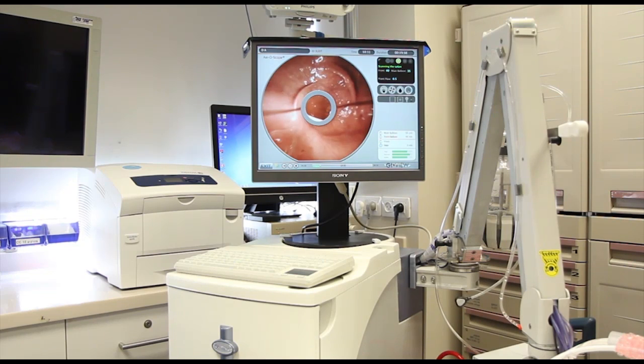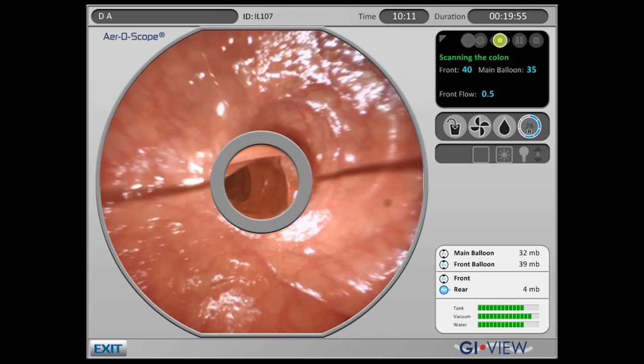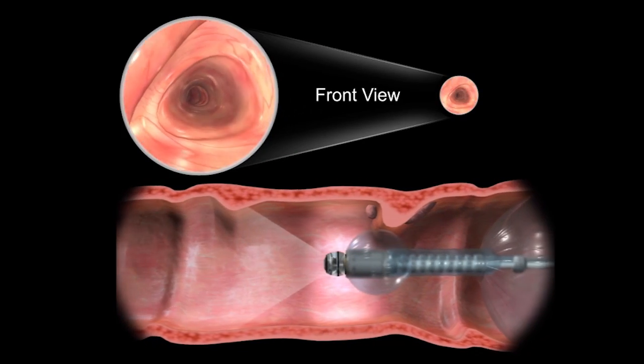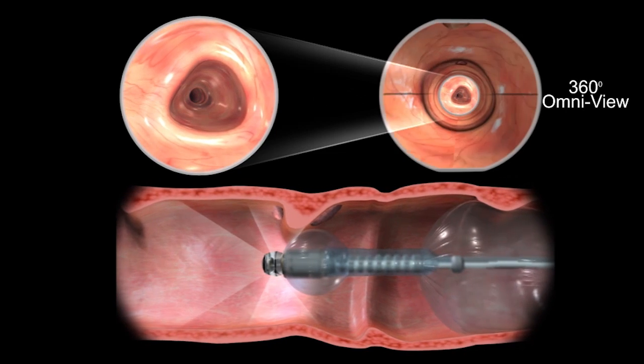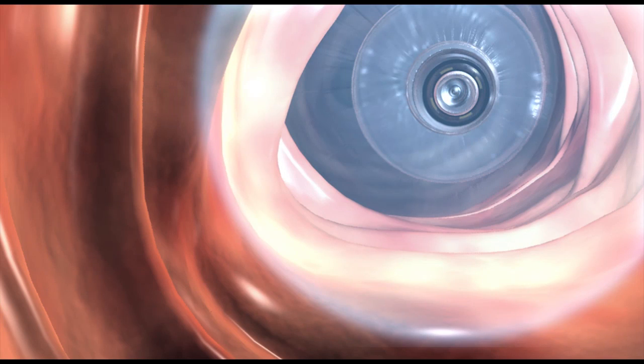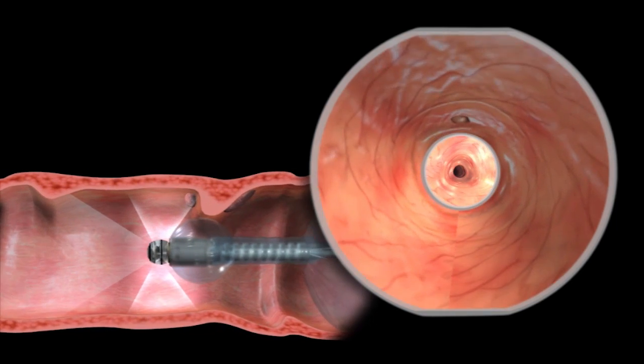The Aeroscope's advanced vision system provides two simultaneous views for visualization of the colon: a forward-looking view and an Omniview, which provides simultaneous 360-degree viewing of the mucosal surface ahead of the capsule, behind it, and to all sides.